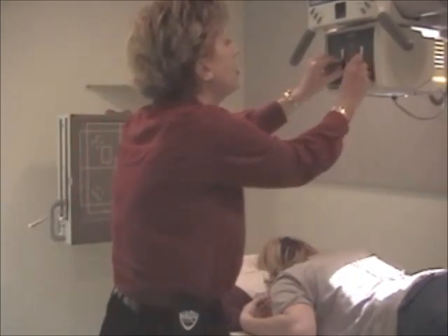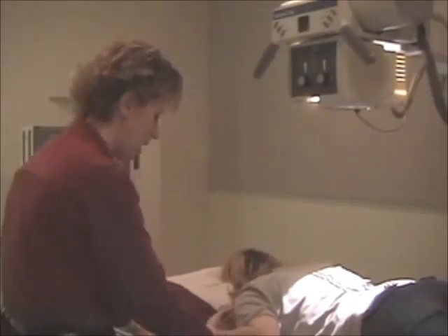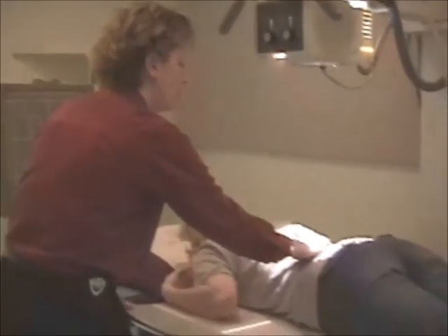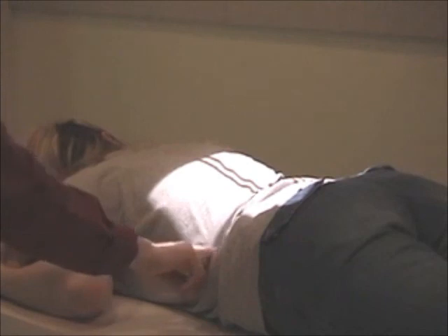And collimation is 17/14. And if the patient allows, you can come in tighter. I'm going to put the mid-sagittal plane to the center of the film. Arms either both up or both down. I can collimate just a little on this patient. And I'm going to position as if it's a KUB, just to show you here. Here's her iliac crest. And I'm putting the center of the film to the iliac crest.